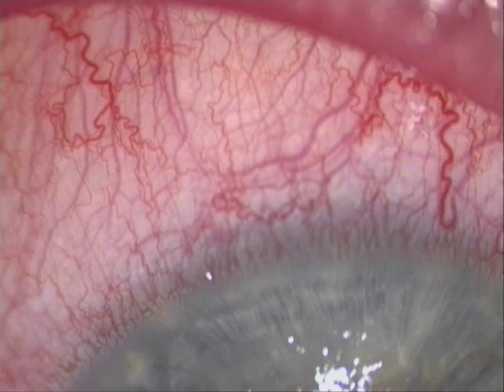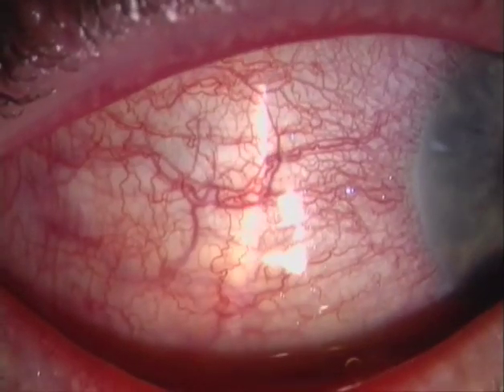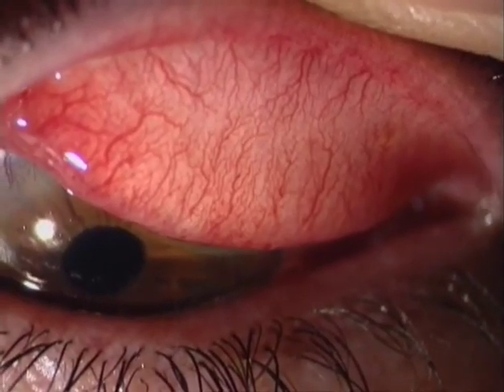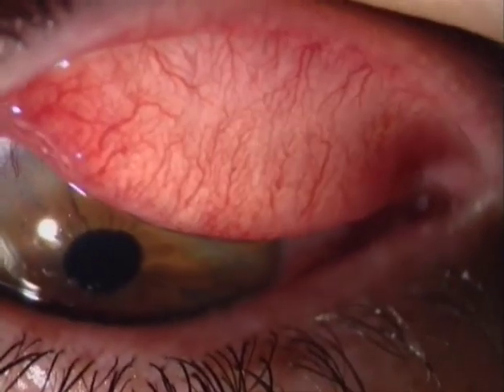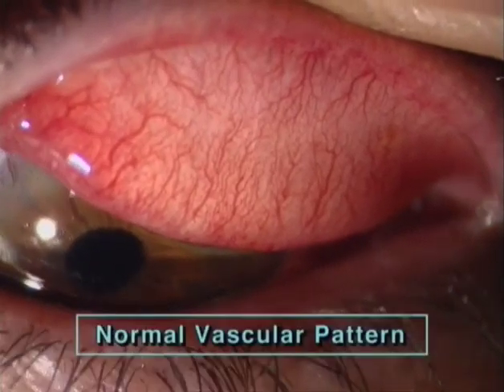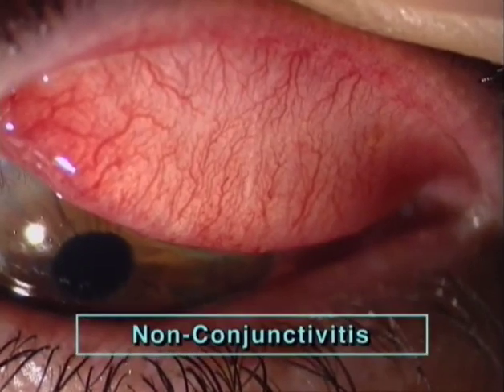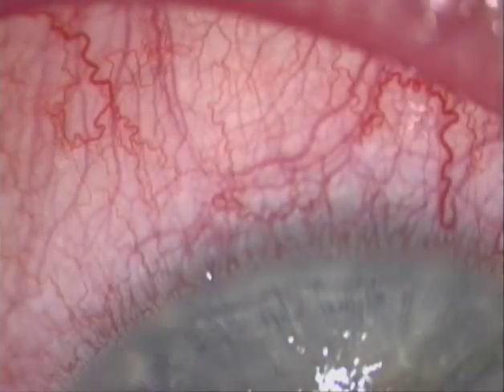In this mild case, the limbal capillary architecture is undisturbed. The vessels on the other parts of the eye are not affected, and this is best checked at the vascular architecture of the upper tarsus, where it is easy to determine whether it is normal. To be explicit, a normal tarsal vascular pattern is an important sign of non-conjunctivitis, that is, of inflammations which are confined to the globe.